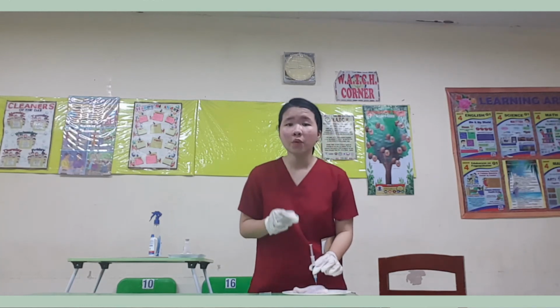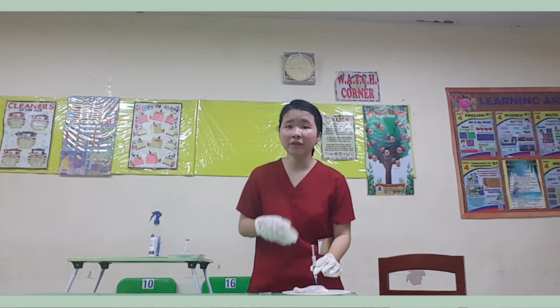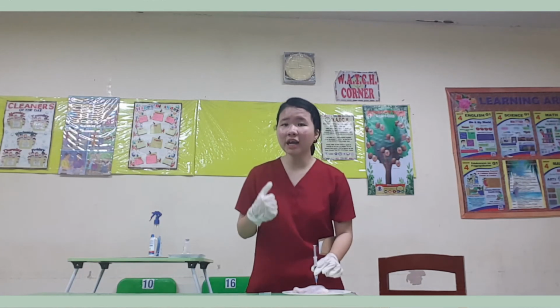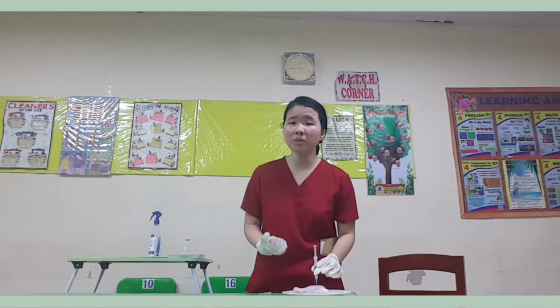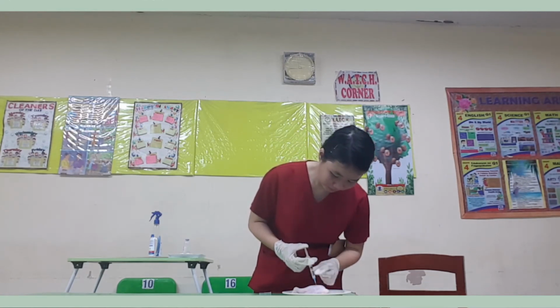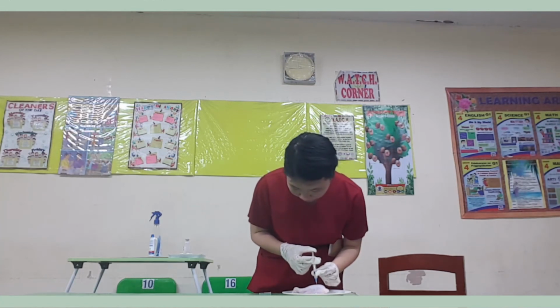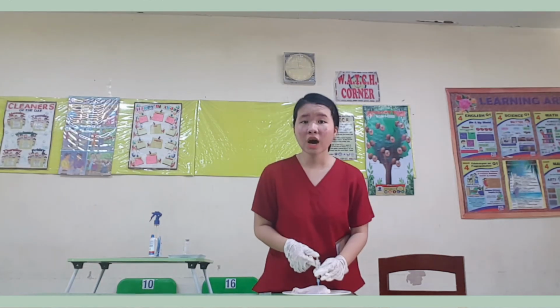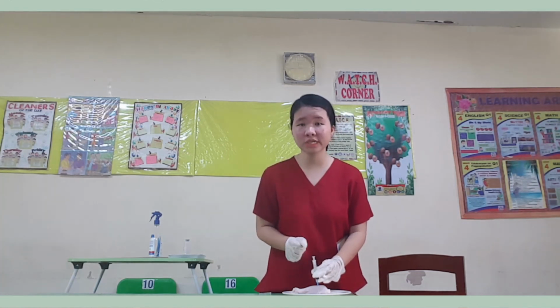So there is no blood. We are now going to proceed to procedure number 21. If no blood is aspirated, inject the medication slowly, 10 seconds per ml. This allows medication to begin to diffuse in the surrounding muscle tissue. Procedure number 22. Count 1 to 10 before withdrawing the needle to stop the blood flow and allow medication to begin to diffuse in the muscle tissue.